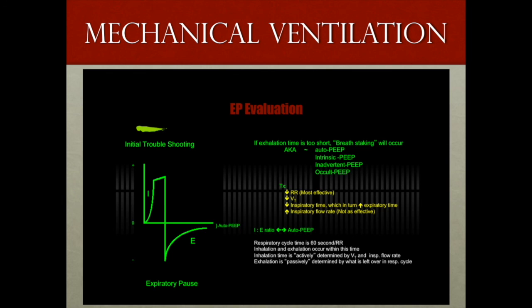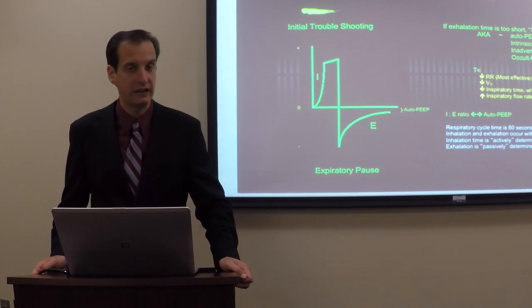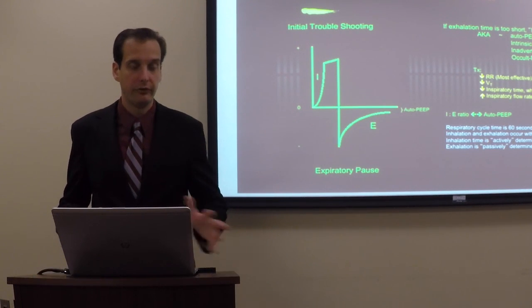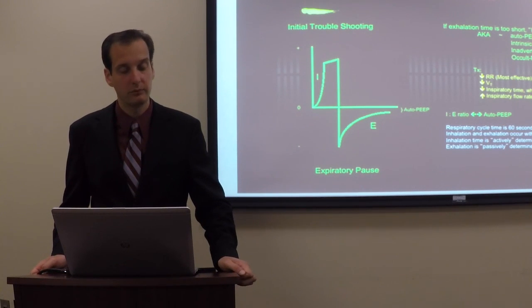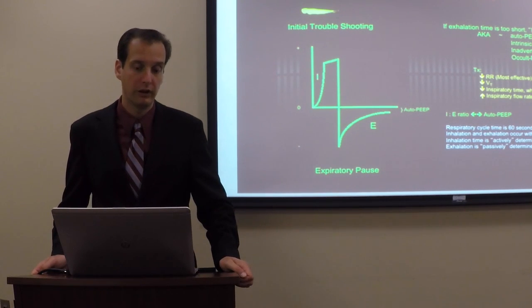If you do have a patient who is auto-PEEPing, and specifically if they are in a hemodynamic compromise, it is best to detach them from the ventilator, have them fully exhale, push on their chest if need be, and then manually bag them at an appropriately slow rate until they stabilize, and then reattach them to the ventilator with corrected settings.